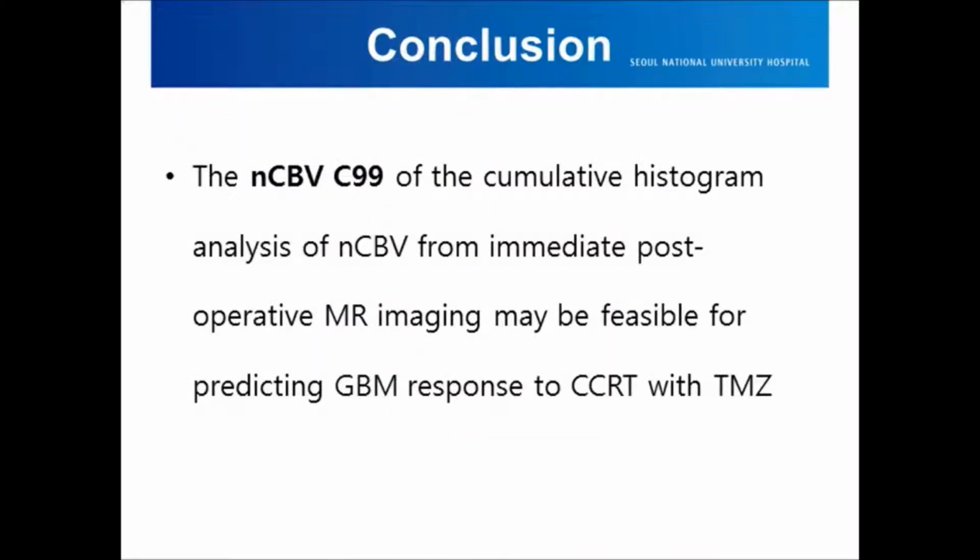In conclusion, the nCBV C99 of the cumulative histogram analysis of nCBV from immediate post-operative MR imaging may be feasible for predicting GBM response to CCRT with TMZ.